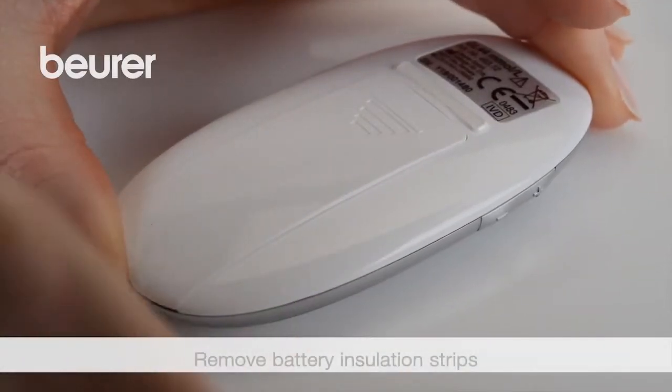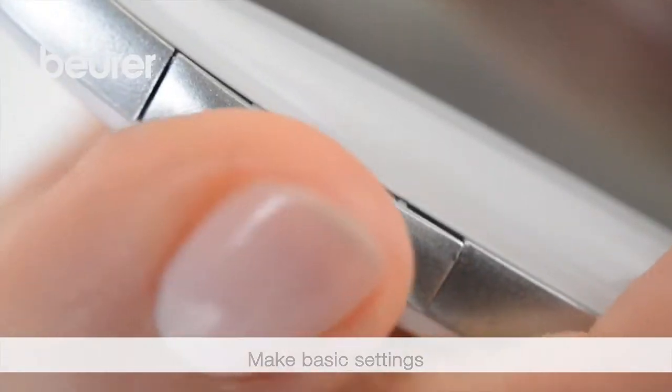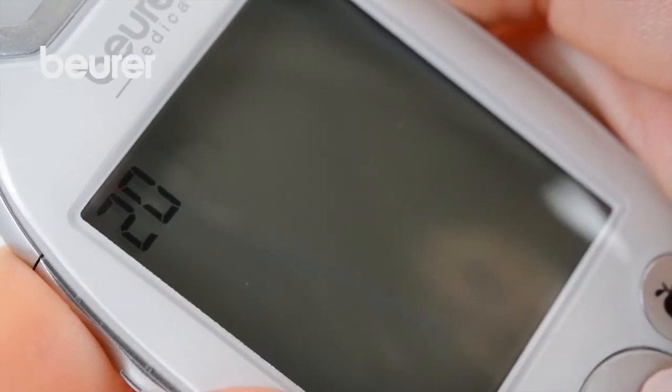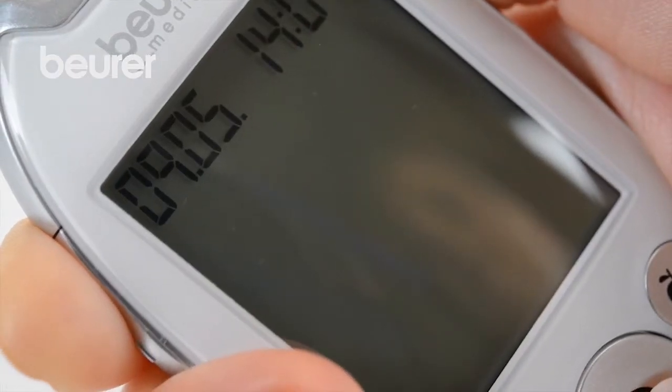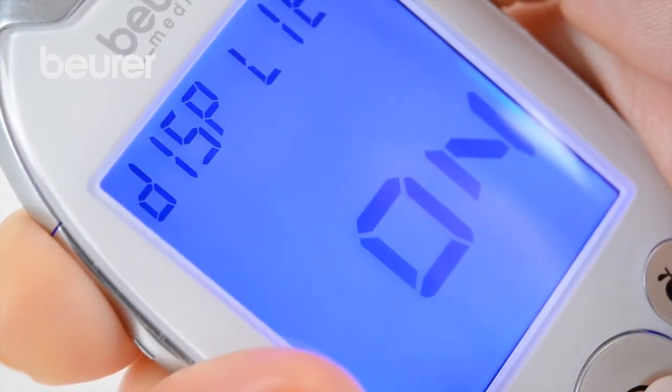Remove the battery insulating strip. Use the plus and minus buttons to set the year, then press on/off to confirm the setting. Use the same procedure to set the day, month, hour, and minute display, as well as the acoustic signal and the backlighting.